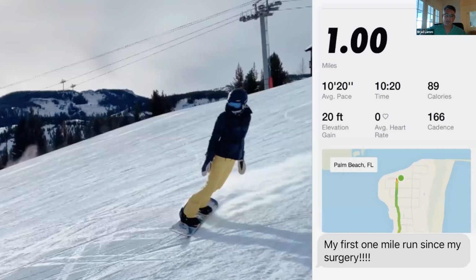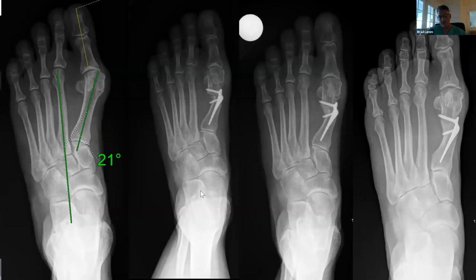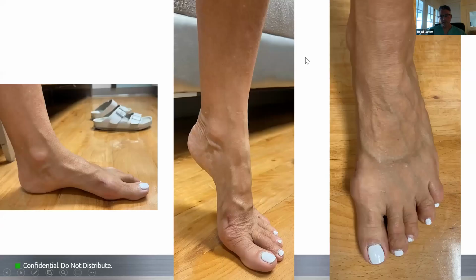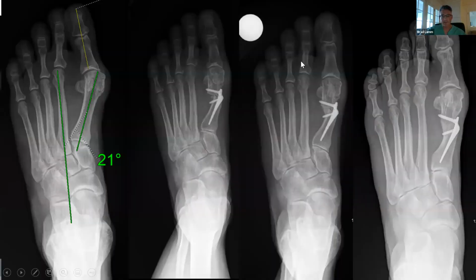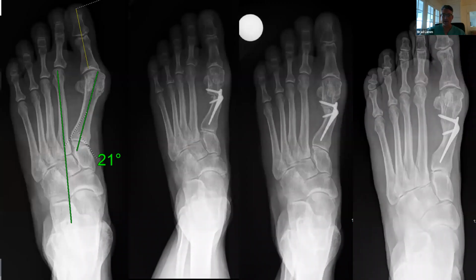Here's case 2, a 57-year-old female with bunion pain for 20 years. She is a golfer and a tennis player. And you can see a pretty, sorry about that. Let me go back here. Pretty good IM angle pre-op, and you see the translation.